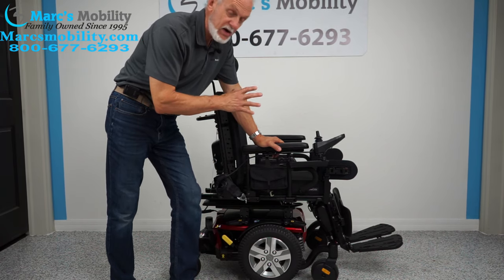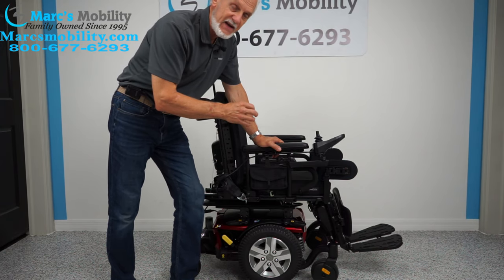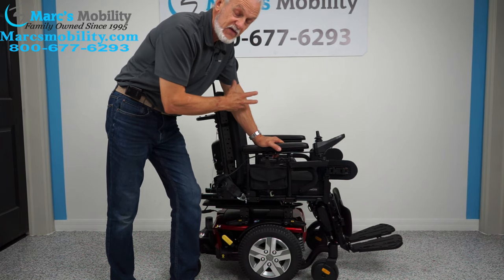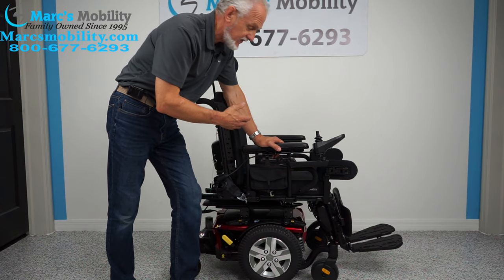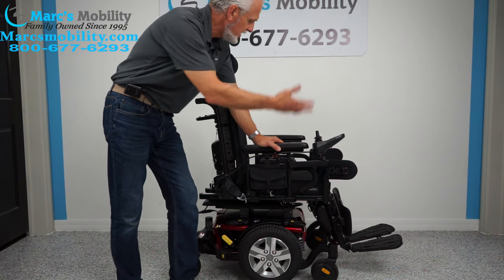The seat on this chair is 20 by 20. We're not going to change the seat because it's a custom seat — it cannot be changed. So if you're going to buy this chair, we cannot change the seat. If you're 5 feet tall, it's going to be too big for you. But if you're 5'10", 5'11", 6 foot, 6'1", or 6'2", this will work.